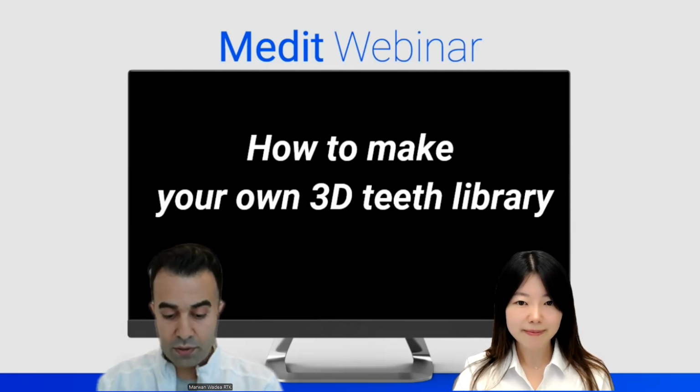So can you tell us some contents that you're going to discuss with us today? All right. So last webinar, we discussed how to do a digital mockup with the help of Medit Design app. And we discussed 3 simple steps. The first step was to import a 3D teeth library. And the question that we got was how to get a 3D teeth library.